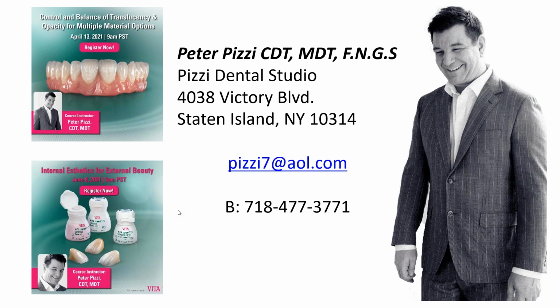No, because I can't count on northeastern daylight savings time at 2 p.m. and 10 p.m. with the wind and the clouds the right direction. It's not countable. So yes, should you have color corrected lights in the operatory? If that was your main question, yes. But really, I'm using the photography in the camera as my lighting, not the environment.